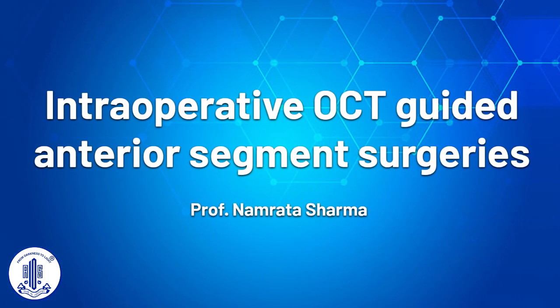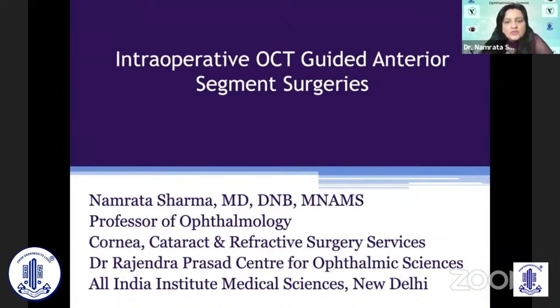So thank you. It is a pleasure to be speaking in this Indo-Russian Ophthalmology Summit on the 93rd birthday of Professor Fedorov. And I would be talking to you about IOCT guided anterior segment surgeries.